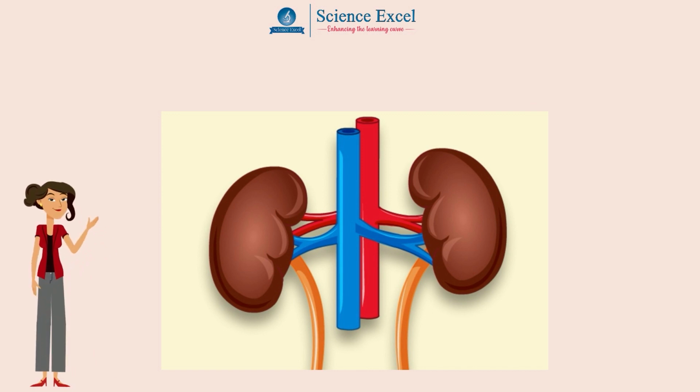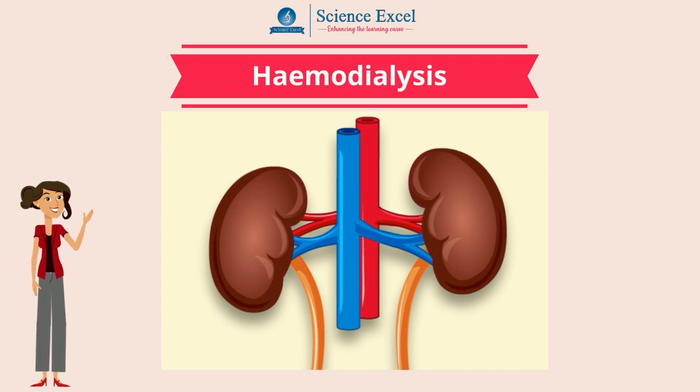And the second treatment is to let the job that was normally done by our kidneys be now done by an artificial kidney outside the body. This process is called hemodialysis. So let us understand how hemodialysis works.